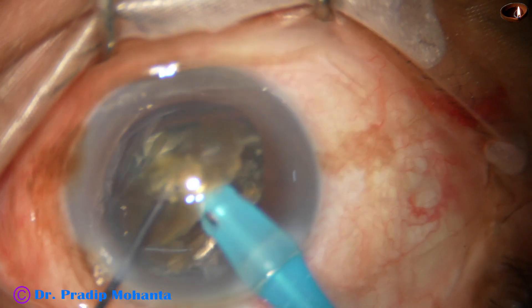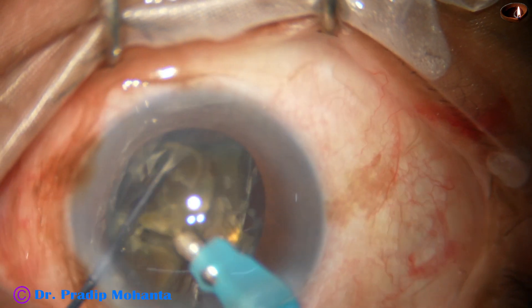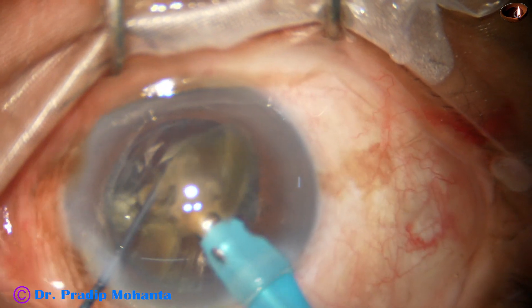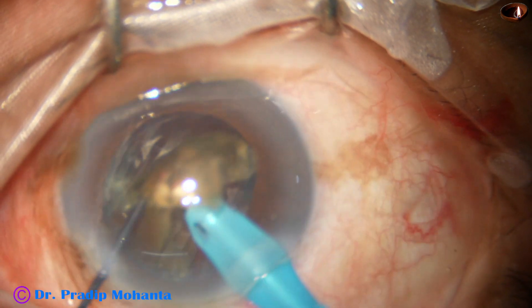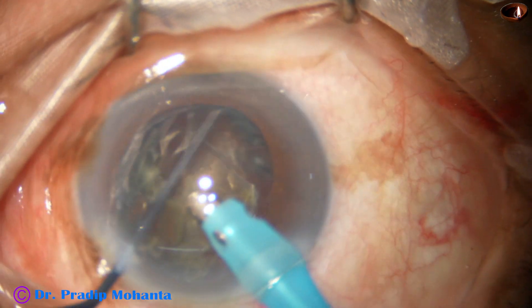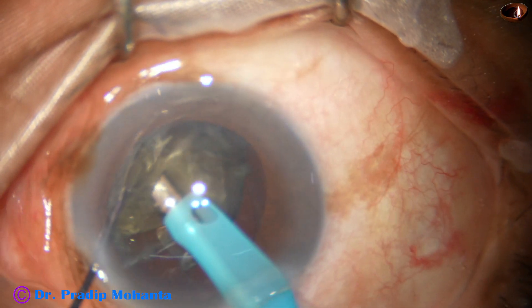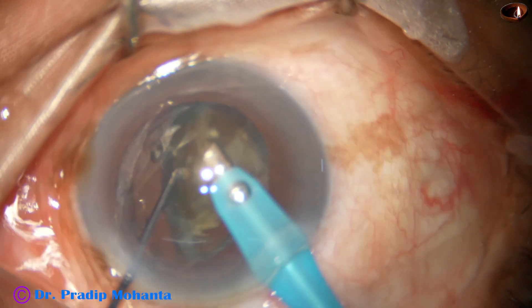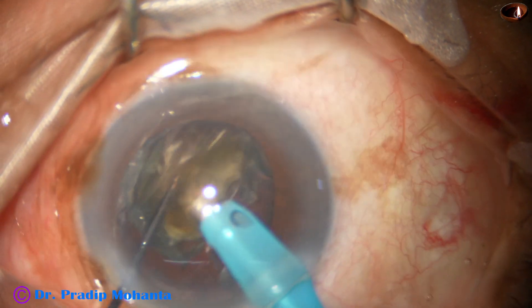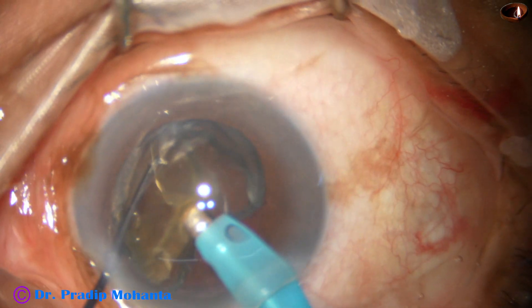Now I detach the epinucleus from this hemi-nucleus and get only the nucleus and emulsify it. I have divided this hemi-nucleus into two pieces and I am using the epinucleus shell as a contact lens over which the nucleus is being emulsified. I am holding the nucleus, detaching the epinucleus with the chopper, and this epinucleus shell is being used as a protective contact lens, protecting the posterior capsule.